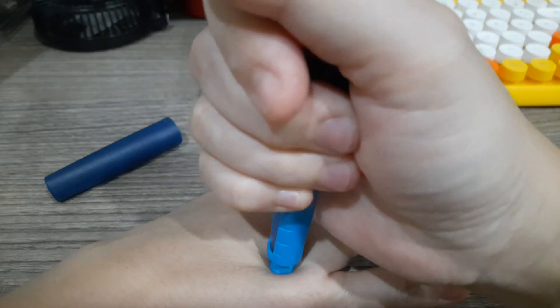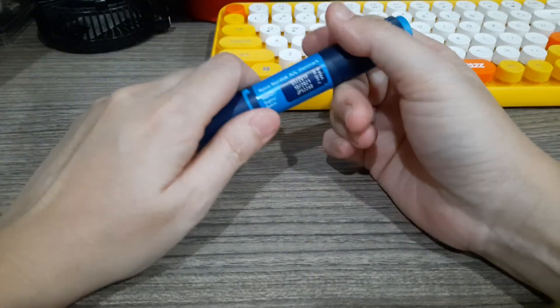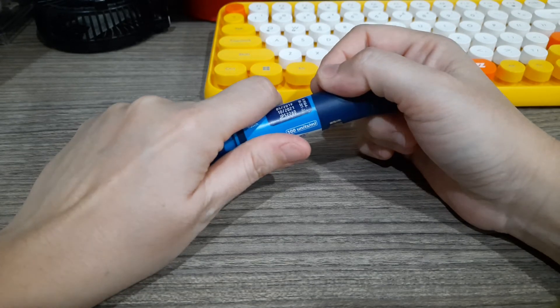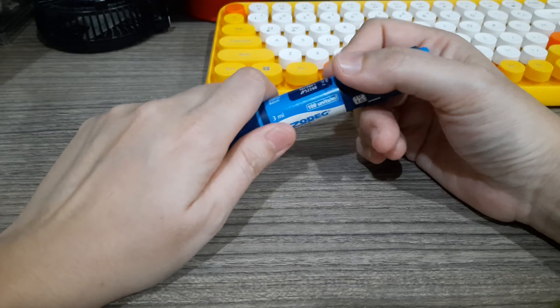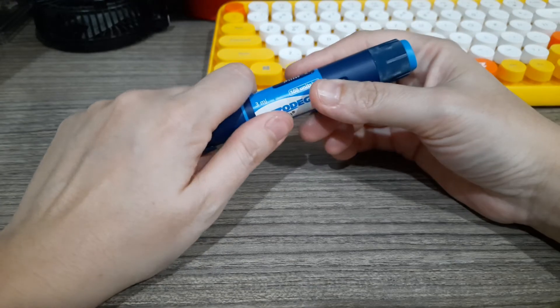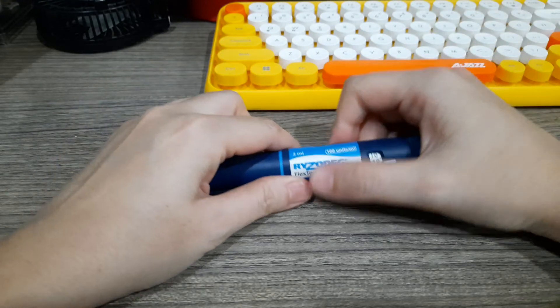Then remove it slowly — no need to jab the insulin into your skin, it will puncture. Make sure you use a new needle every time. If you really want to save, you can use the needle maybe twice, but if you use it more than twice it will be blunt and that's more painful. Ideally use it once and there's no pain.